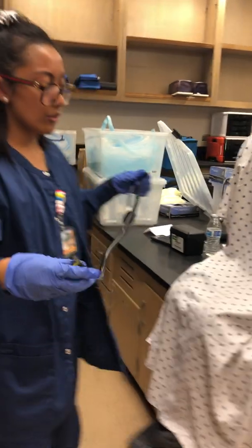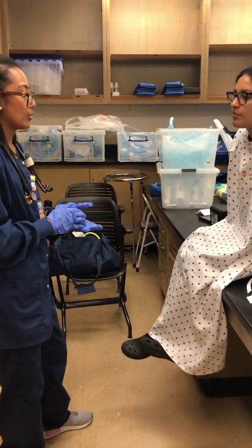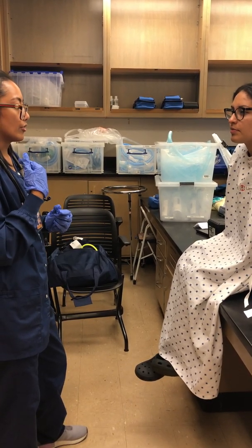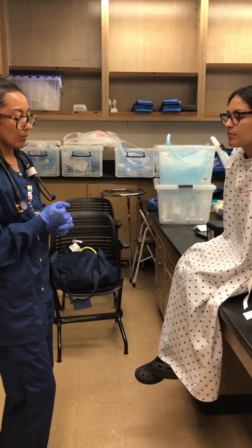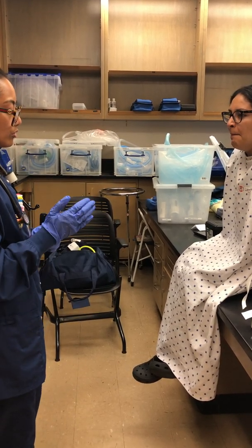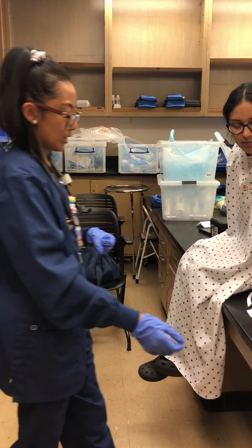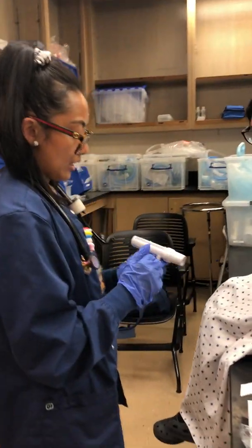So after listening to your lungs, I did hear a little bit of wheezing, so you will be getting some albuterol through a metered dose inhaler. And I also checked your neck for any stridor, which is clear. Okay, so just some albuterol today. But prior to getting the albuterol, we're gonna do some little breathing measurements with your peak flow meter. So your goal is to reach 390.